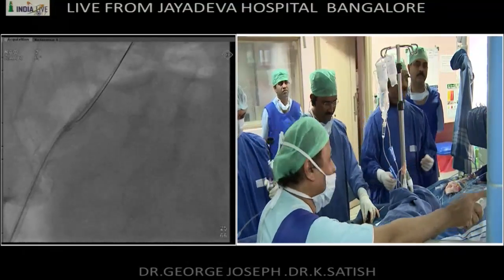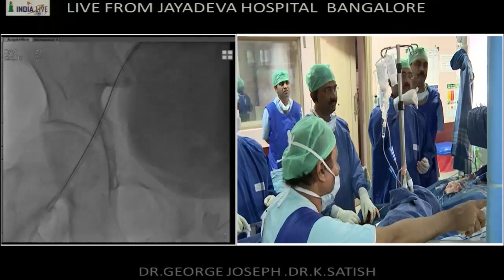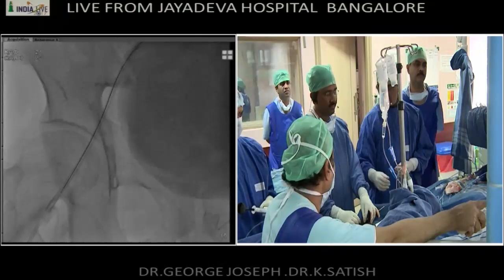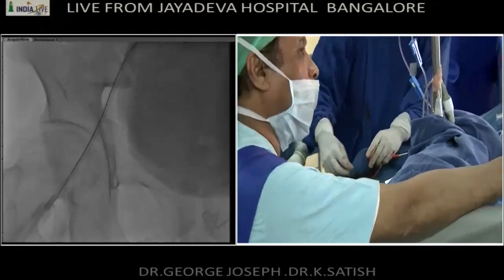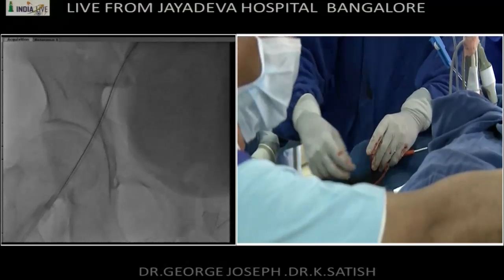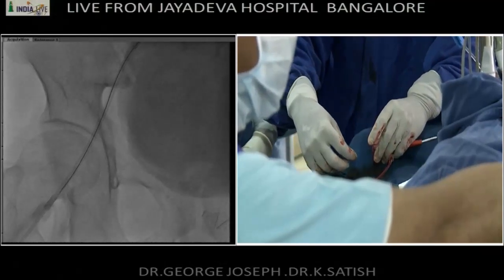Now, I'm not able to advance it freely because it's going over the top at the aortic bifurcation. So I'm going to now trap this wire inside the guiding catheter with a coronary balloon so that I can just pull it out from below. So there, you can give one mag there, please.